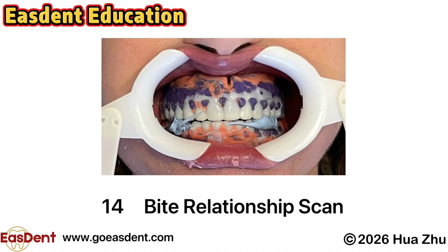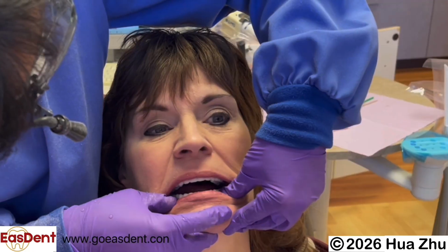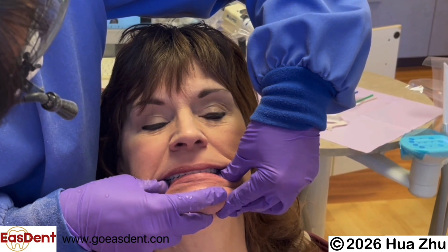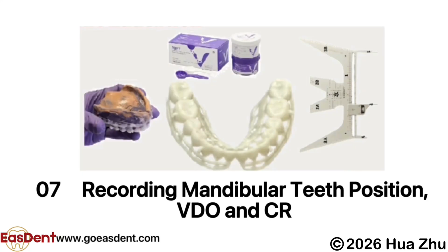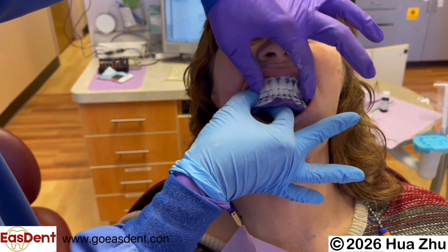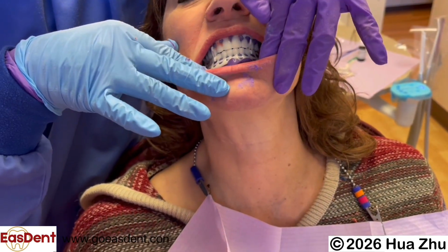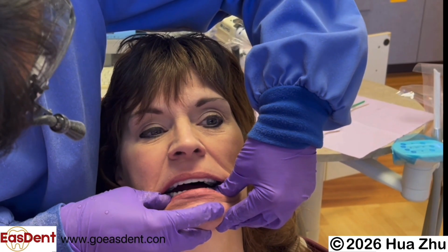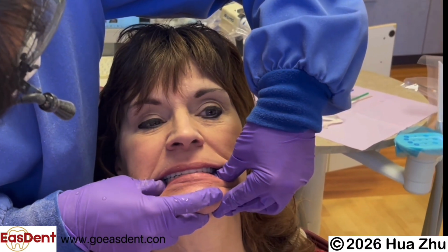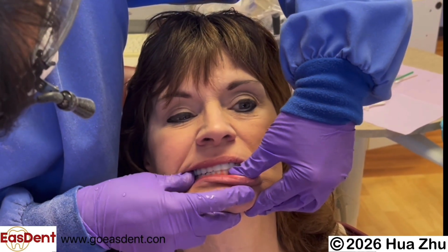Bite relationship scan. Seat the Easdent impressions in the mouth. Evaluate whether the Easdent teeth are in maximum intercuspation when the maxillary and mandibular jaws are in centric relation. Ideally, at step 7, recording mandibular teeth position, VDO, and centric relation, when you hold the teeth in maximum intercuspation and guide the patient to bite into centric relation at the pre-measured VDO, after the moldable material is set, centric relation should coincide with maximum intercuspation. If the two coincide, you can have the patient bite down and scan the bite relationship in the mouth.